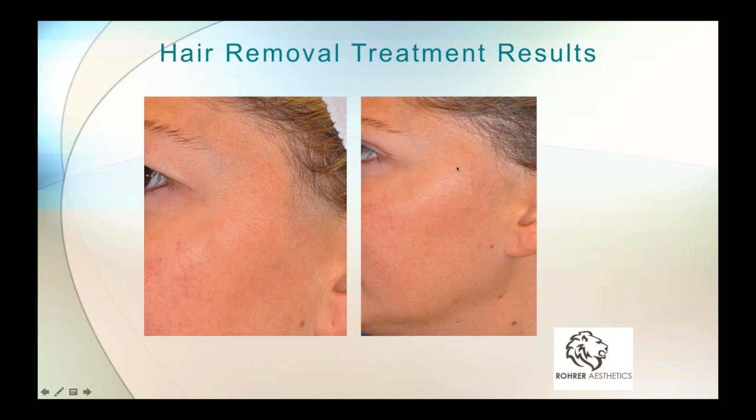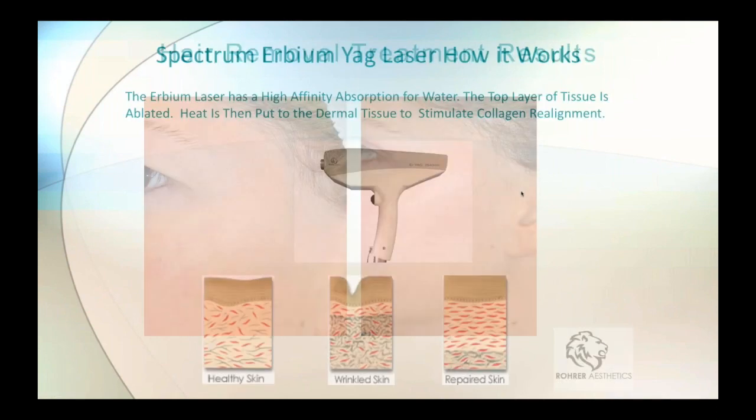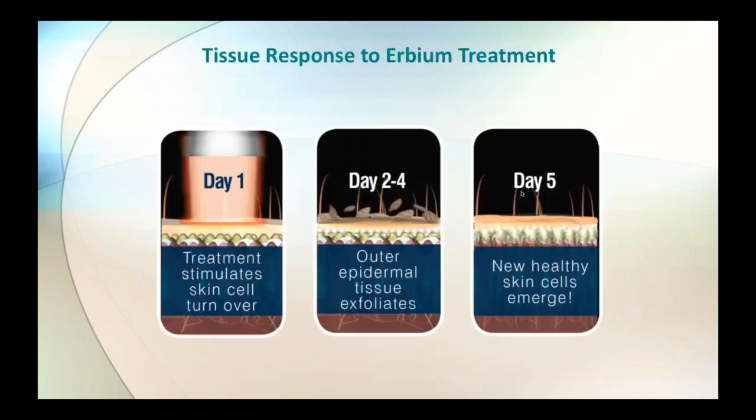This is one of the patients that my wife has been treating. She just wanted, so you could use this very focally, to change the way her sideburn is, and this was just after like 2 treatments right here on this young lady. The erbium YAG has a lot of utility.